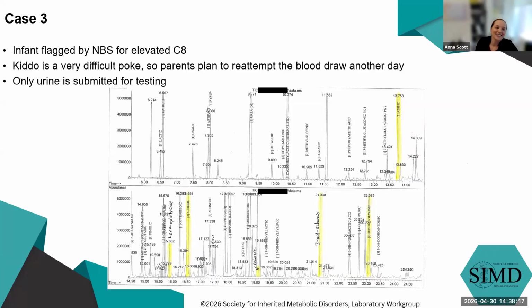Yes, this is MCAD. Love the audience participation here. So this was a kiddo, flagged newborn screen. We're worried about MCAD. We got this urine sample, but we don't have blood yet.